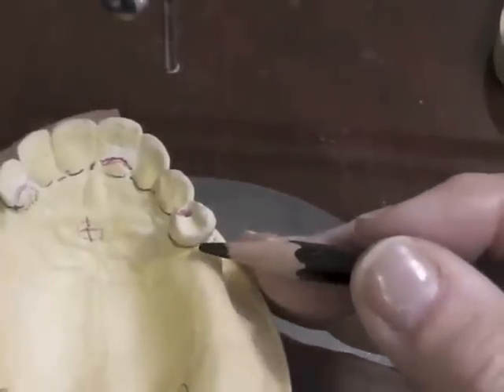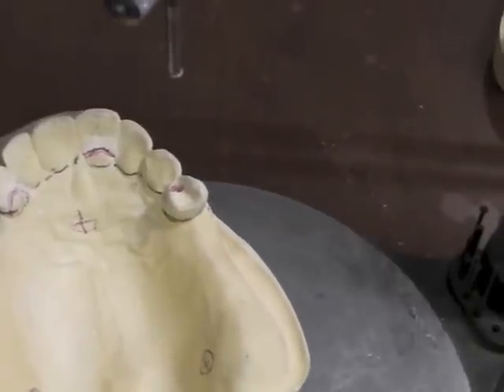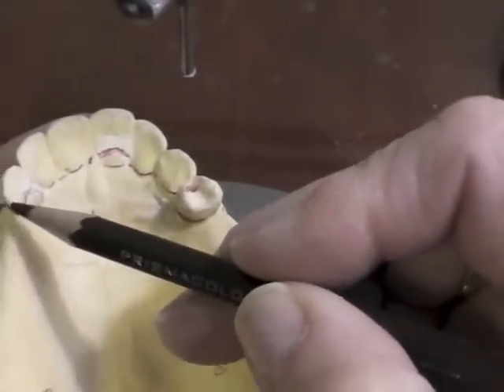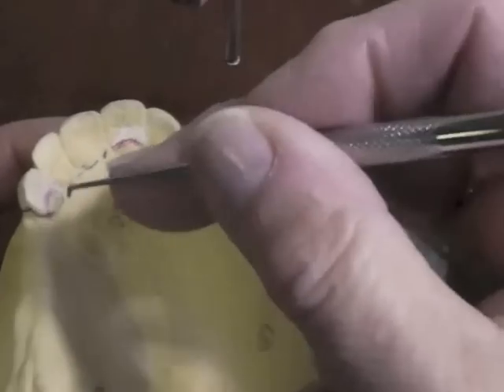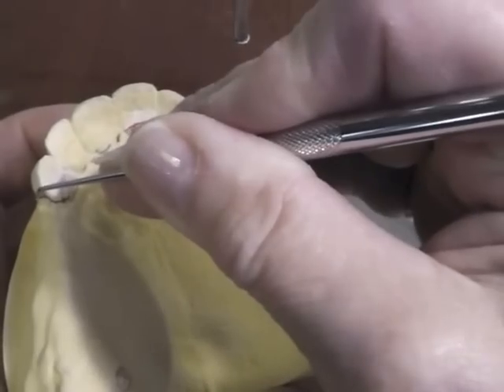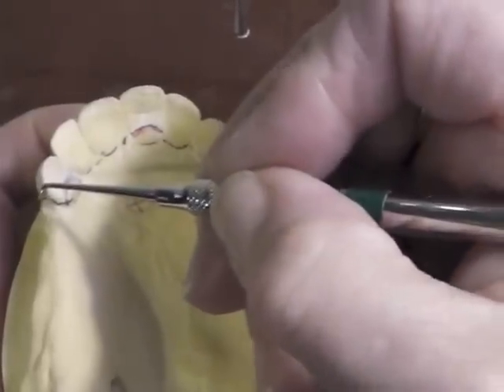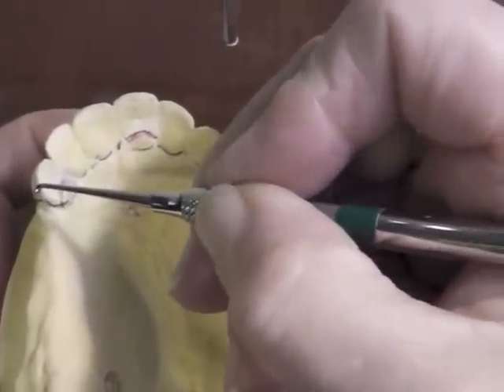Now I'm going to look at my guiding planes. If I had a high survey line I would cut guiding planes in that area, but I appear to have a couple millimeters of space here so I don't have to lower my survey line from the marginal ridge. I may take this down to give myself a little room for that wrought wire to come over there above the survey line, so I may alter the tooth slightly to make room for my clasp arm to come above the survey line.